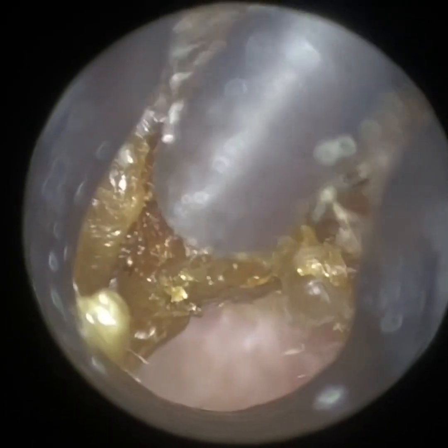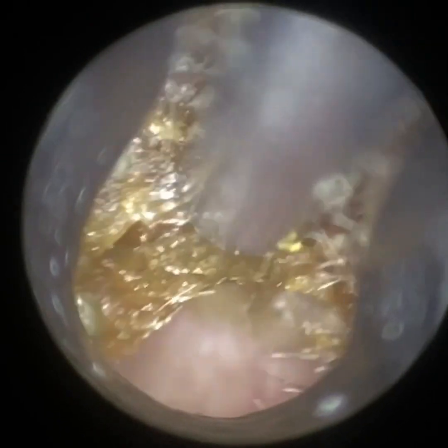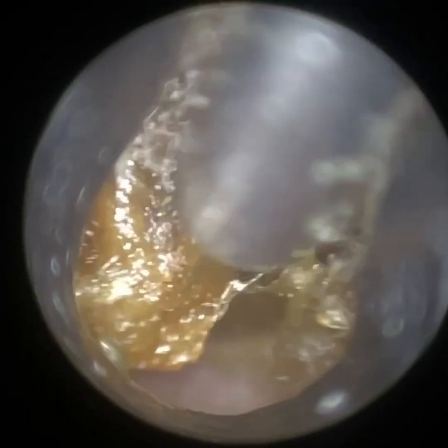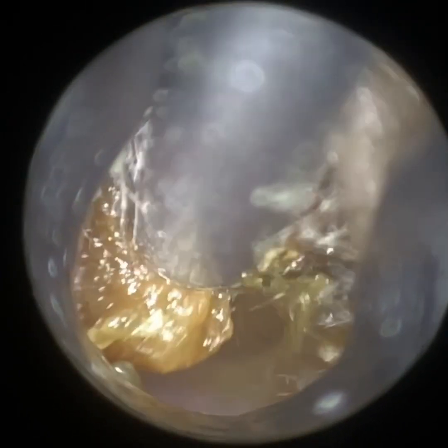So interestingly, this case is of a colleague, a fellow audiologist who I've known for years, and they attend perennially really every year to have their earwax removed. They have quite a narrow ear canal and a very bendy ear canal. I'm just commencing here — I think it's their left ear, which we'll see in a moment.